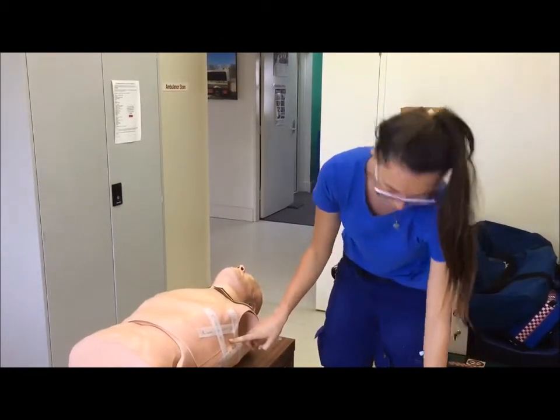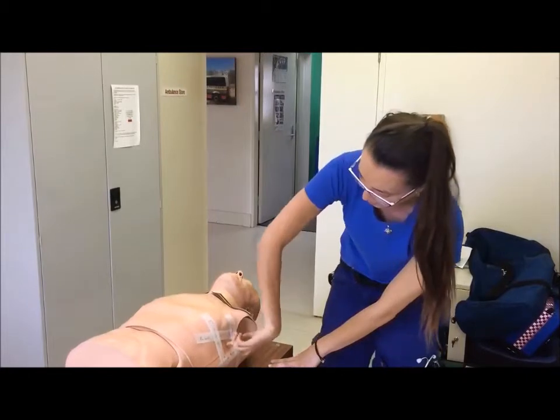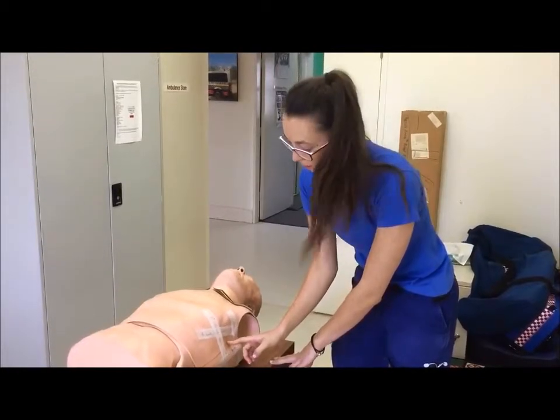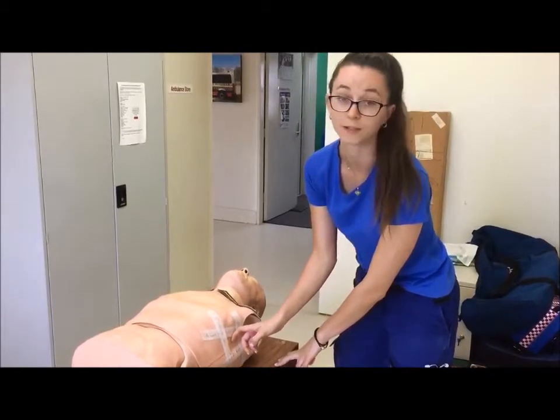We would then remove the forceps once the finger is inserted, and we would do a 360 sweep to make sure that we can palpate the parietal pleura and to make sure that any air has escaped and that there is re-expansion of the lung.